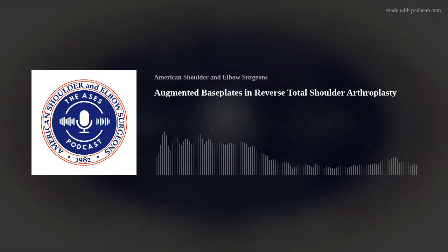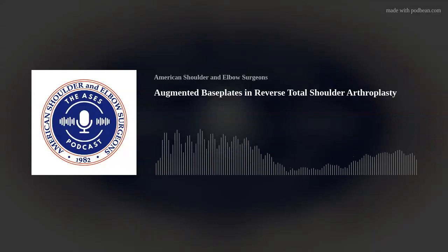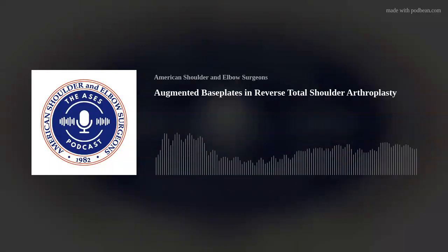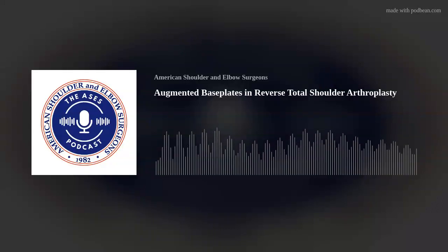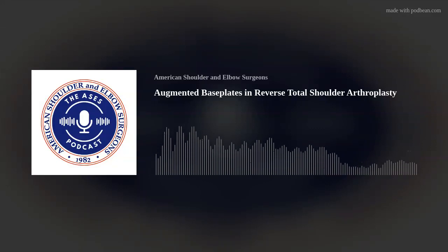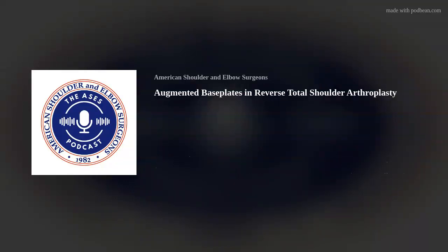Yeah, I agree with you wholeheartedly. I think the next scenario probably will tease it out even more. So if we flip the script then and we start talking about that individual with cuff tear arthropathy, that more superiorly based wear, if you want Favard E2 or E3 glenoid, let's go in reverse order. Chris, tell us how you're managing that deformity and what are you doing for this bony deficiency?